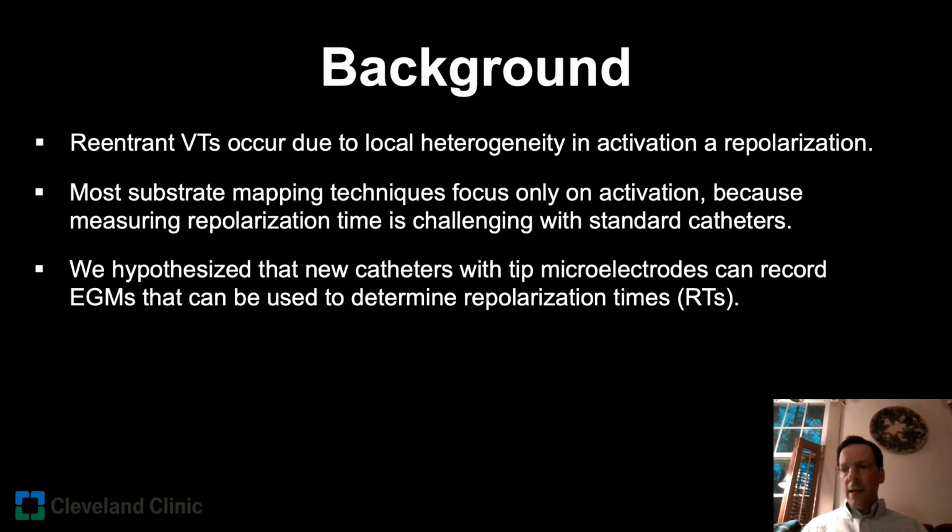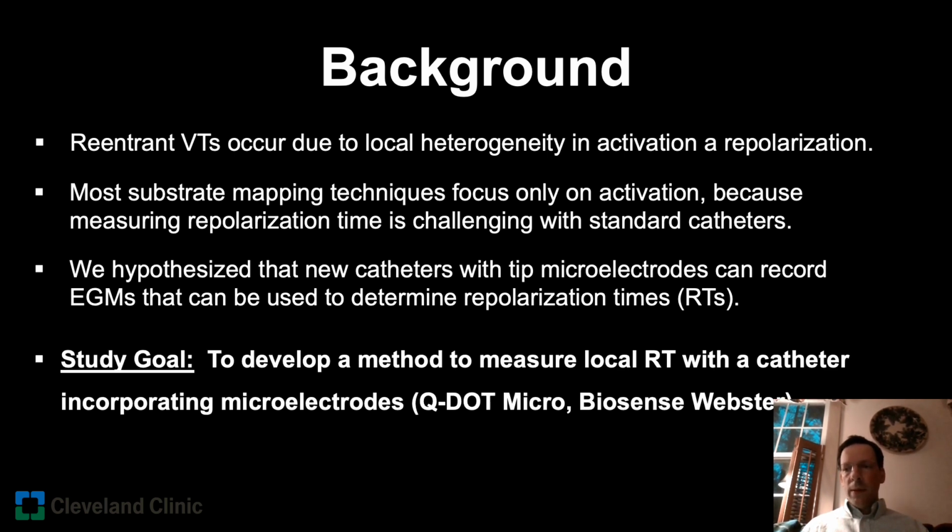We hypothesized that new microelectrode catheters may be well suited for repolarization time assessment. So our specific study goal was to develop a method to measure local repolarization time using a novel microelectrode catheter.